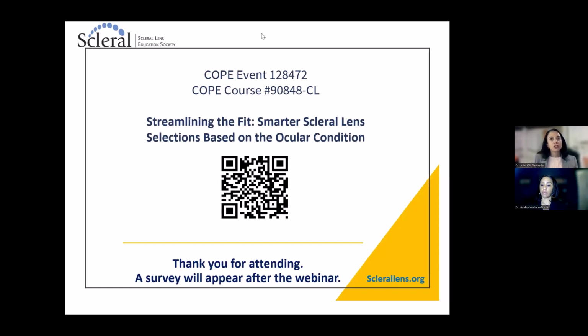But when you're actually adjusting the periphery, I find even if they're at oblique, when you make those changes you want, that lens is going to end up locking in. When you make the changes and it's tightened closer, it's going to lock in a little bit. Then you might find that next time you look at those markings, because you've tightened it up, they're not really oblique anymore, or maybe they have become oblique. But that's just the lens finding its spot when you got it better aligned to sit evenly out there on the sclera.